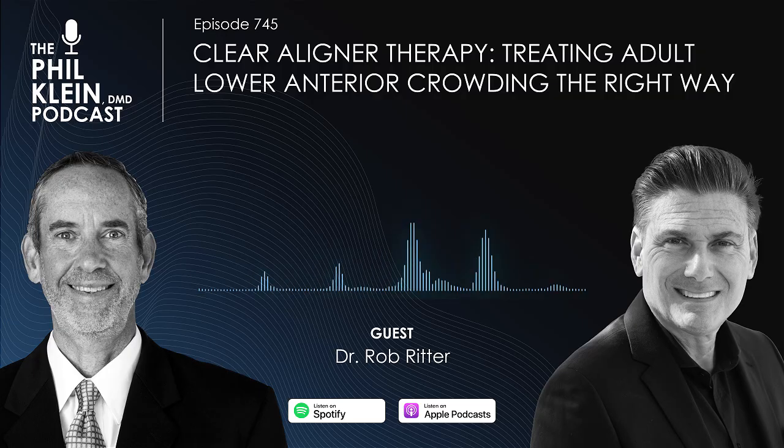And myself included, and my wife as the example. My wife went through orthodontics when she was a child. Let's use her as an example. Interesting case, they pulled out one premolar on the maxillary arch, kept the other premolar, and she had relapsed through the years. My wife is now into tray 21 of 25 of Invisalign because she noticed the crowding, she noticed the wear. And what happens is over time, we know that we can get wear of incisal edges, we can get a collapse of the bite, we get compensatorial wear as well.